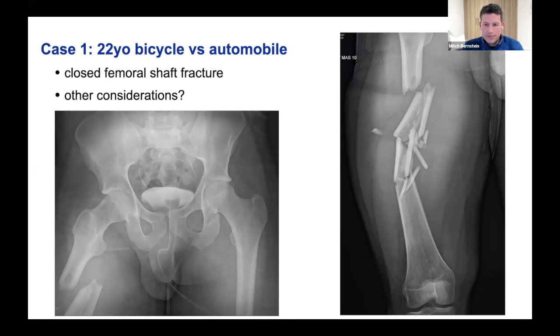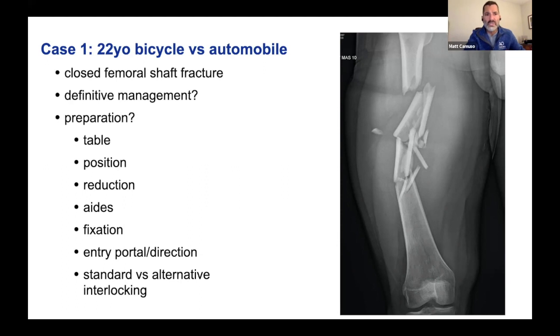That's fine. Well, you thought enough about it that you got x-rays of the hip so that you showed that there was no femoral neck fracture, at least here. And I will tell you that on the CT scan of this patient, there was also not a femoral neck fracture present. So we've ruled that out, and now we can just focus on this difficult femoral diaphyseal fracture of the femur. So I think everyone does this a little bit differently.